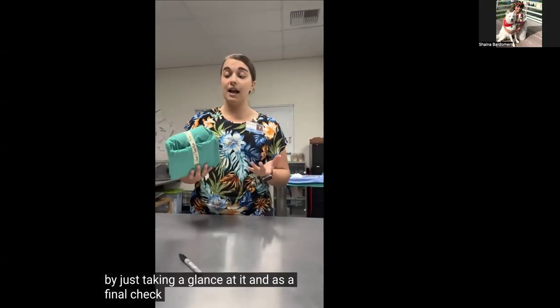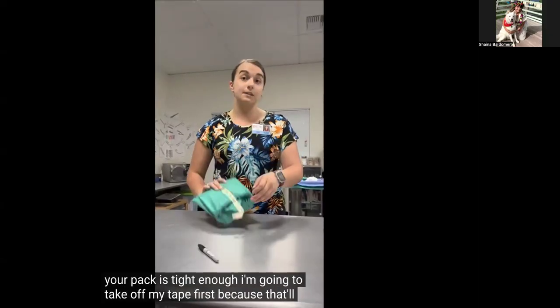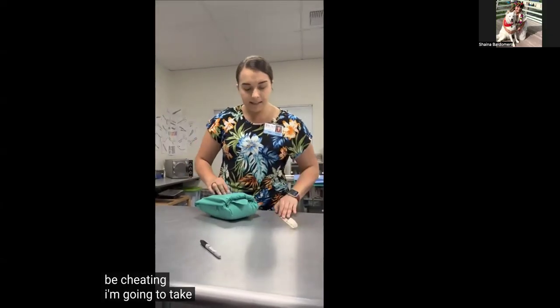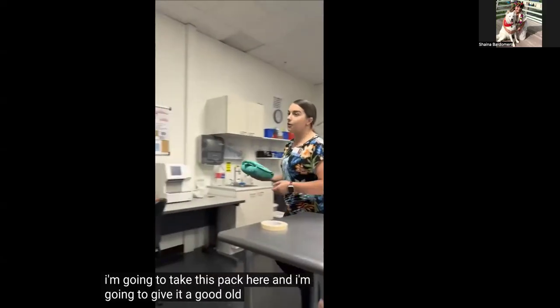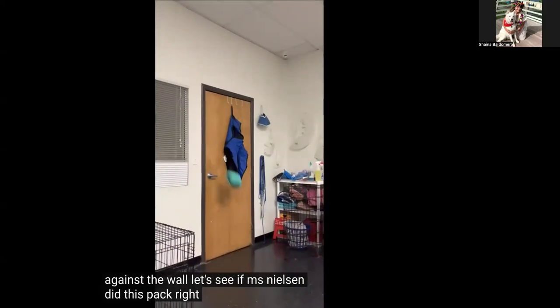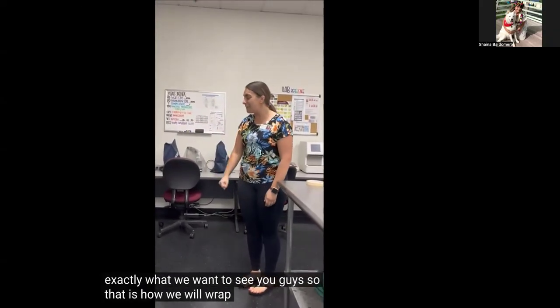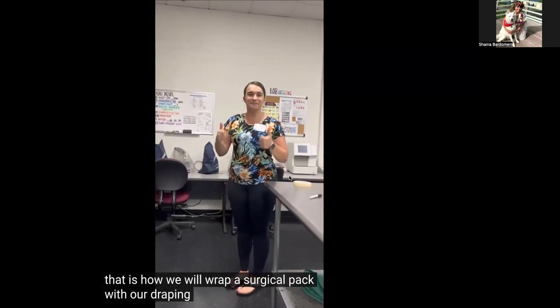And as a final check, if you want to make sure if your pack is tight enough, I'm going to take off my tape first because that'll be cheating. I'm going to take this pack here and I'm going to give it a good old throw against the wall. Let's see if Miss Nielsen did this pack right. And it stayed, it's good. So that's exactly what we want to see, you guys. So that is how we will wrap a surgical pack with our draping.